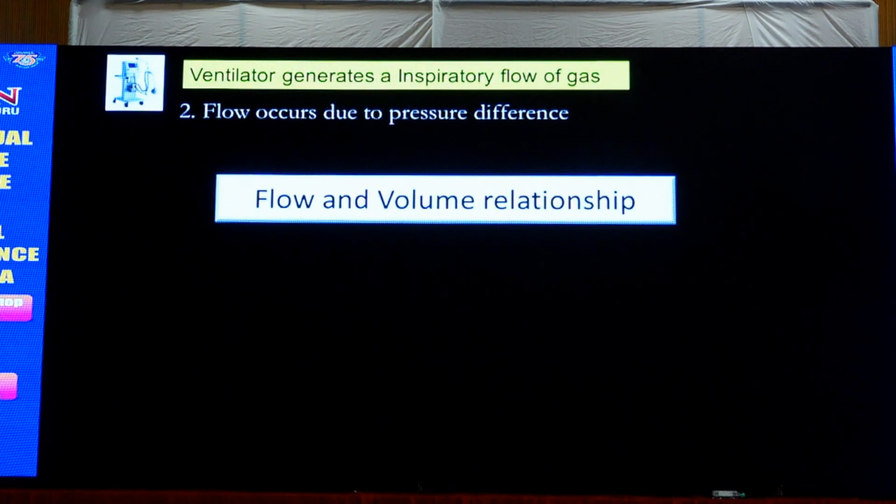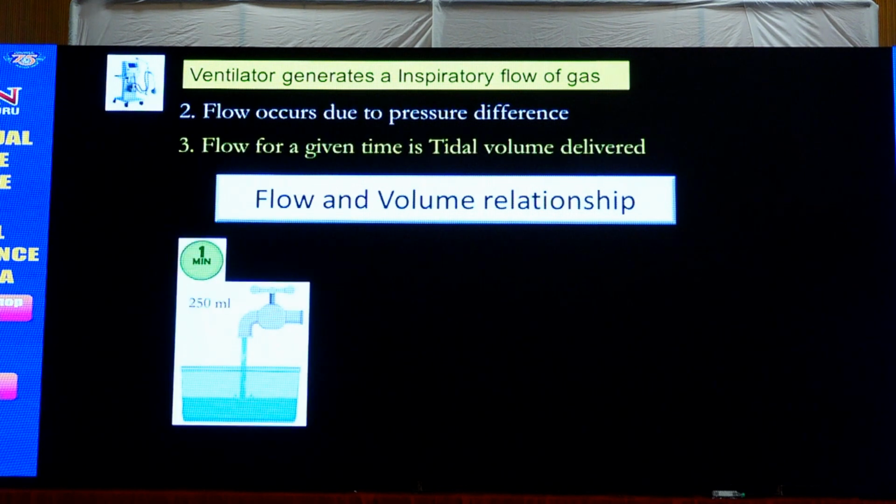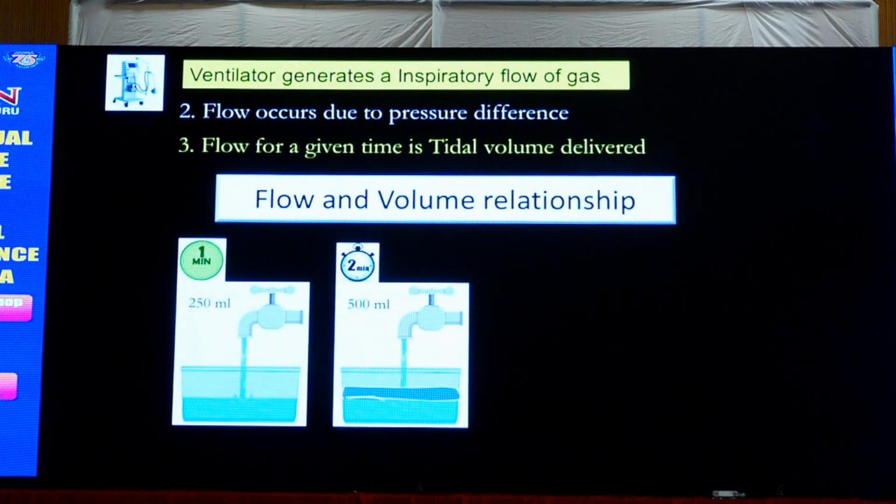So what is the relation between volume and flow? Both are the same. How are both the same? See here. If I have a bucket with a flow, and if I fill the bucket for 1 minute, and then fill the bucket for 2 minutes, what is the volume I have collected? It is double. So flow, when you look at it in the context of time, becomes volume. Both are the same. A flow in the context of time is volume.